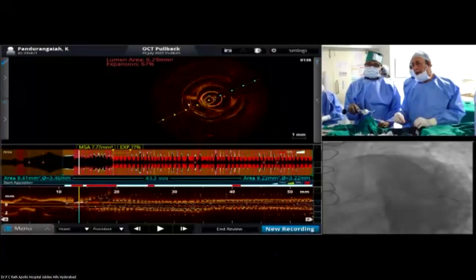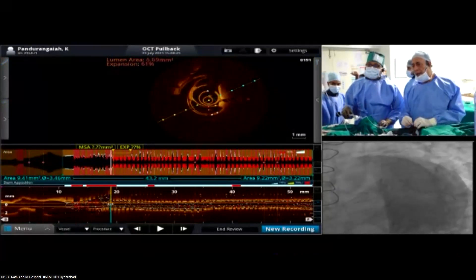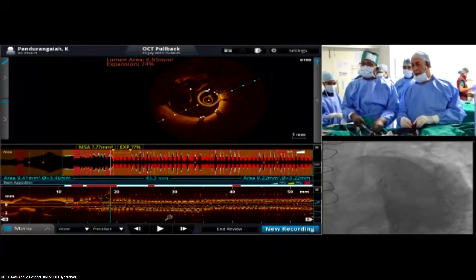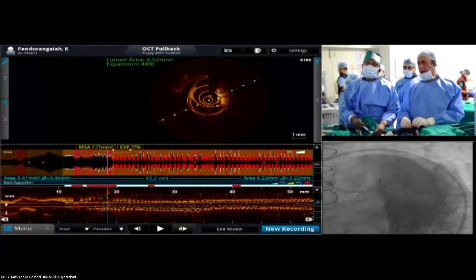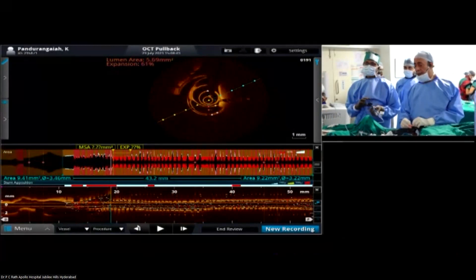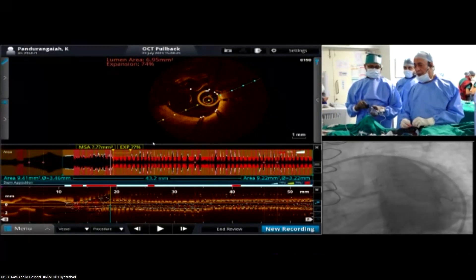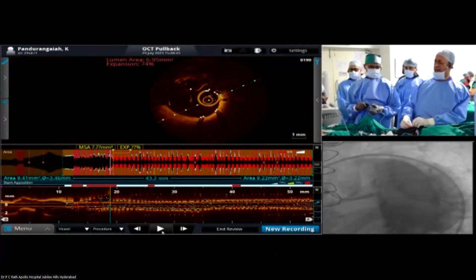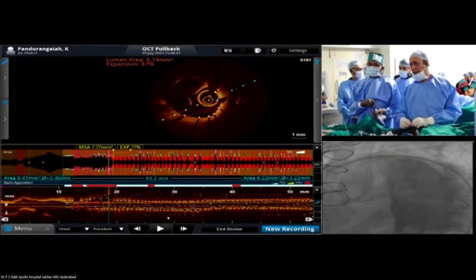Can you go back to the OCT? I have the impression you have to perform post-dilation. Yes, we are planning to take a 4.5 millimeter balloon — it's already a 4.5 balloon. We are dilating the ostium, 8mm, at 8 atmospheres, and then deflating.